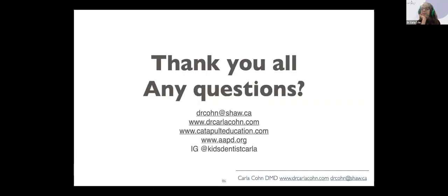Thank you. So Carla, quick question. First question that I'm getting asked: do you routinely, when you're doing your technique with RevaStar, acid etch for 15 seconds? That's a great question. We know that evidence shows us that if we can acid etch for the 15 seconds prior to the placement of silver, we're going to have better penetration.